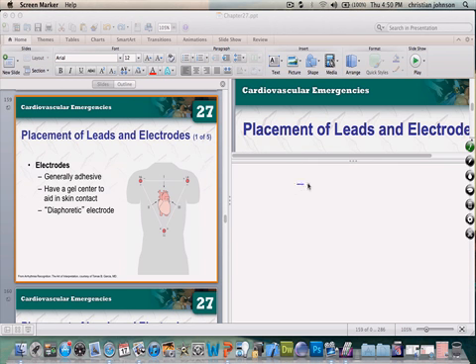So, Einthoven's triangle. We've got a little triangle here, and we're going to draw it. This is a little doodle to help you understand. When we put our stickers on our patient, we have white right, smoke over fire, and we have our green lead. Together that makes our 4 lead. But we don't need the green lead to make our basic 3 lead, which is what this diagram is showing. This 4th lead is going to give us 3 more leads that we're going to talk about later.